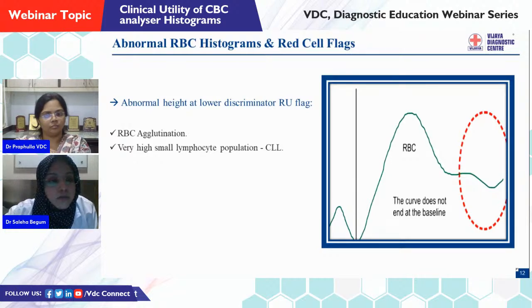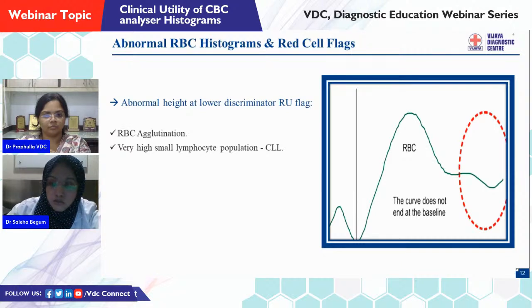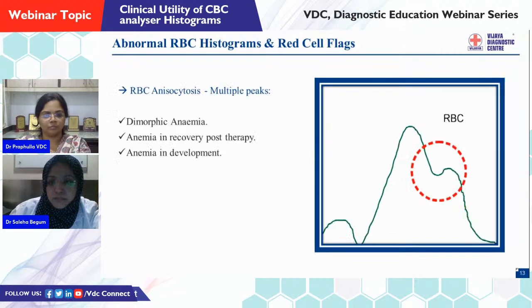In case of a very high lymphocyte population such as CLL, usually lymphocytes do not interfere with the RBC graph, because they are present in statistically insignificant number. When this number becomes high, such as in leukemia, the count goes in lakhs. So that's when they interfere with RBC detection. They are counted as particles in the RBC chamber, and that's how the graph ends at the upper discriminator, not touching the baseline, giving us the clue that there are some larger particles present in the blood than the usual RBCs.